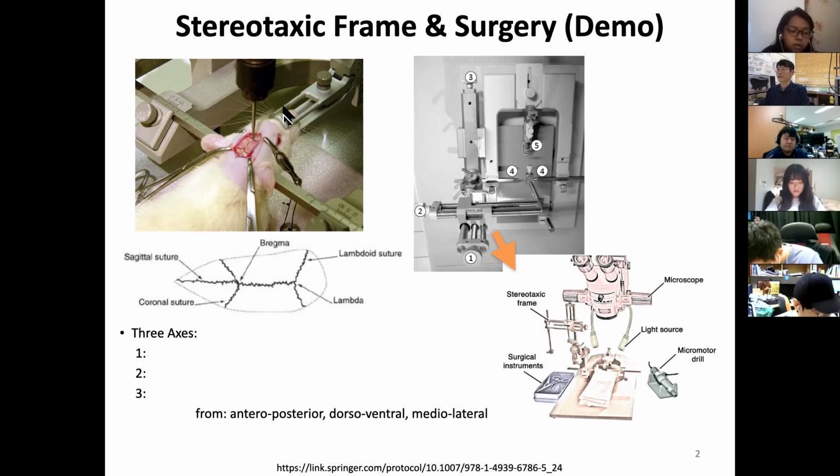So be ready, if you really touch, I think you feel the sense. Look at this craniotomy surgery with a drill. You already know that this is what you will be touching this Wednesday. And you see this numbering 1, 2, 3, 4, 5. And so the actual craniotomy surgery suite looks like this.